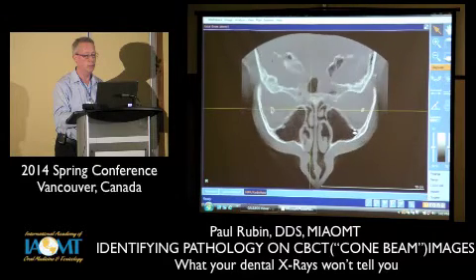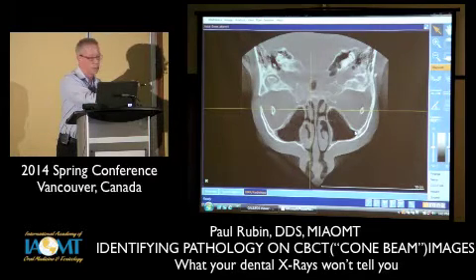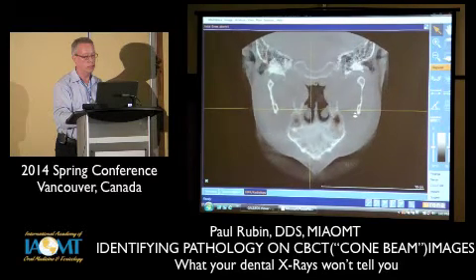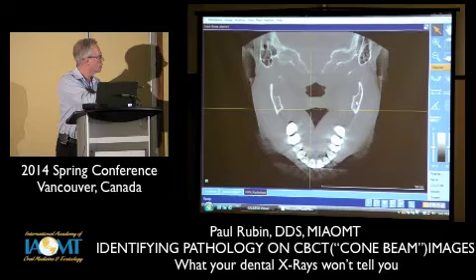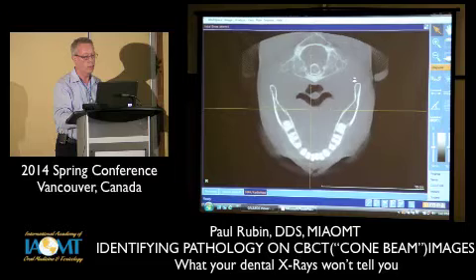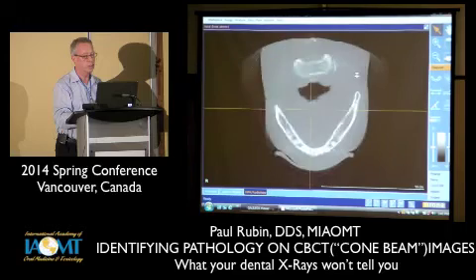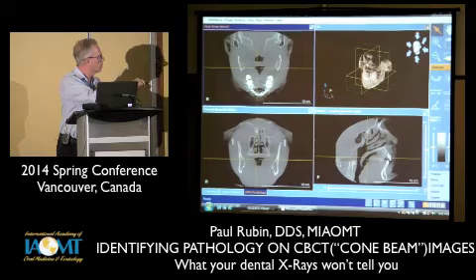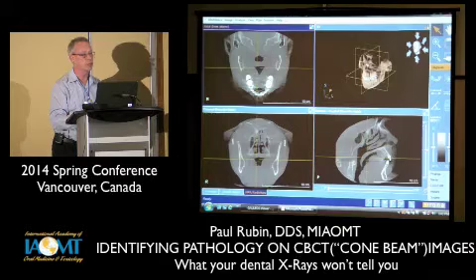And again, scan through here, and you start seeing things like the sinuses. You keep going down, and we'll start running into where the maxilla is, etc. You're starting to see the airway here, the mandible, etc., and on down. So you're going to want to scan through that whole image, really looking at the whole skull and not just the teeth, and looking for abnormalities, looking for things that look different than they should.